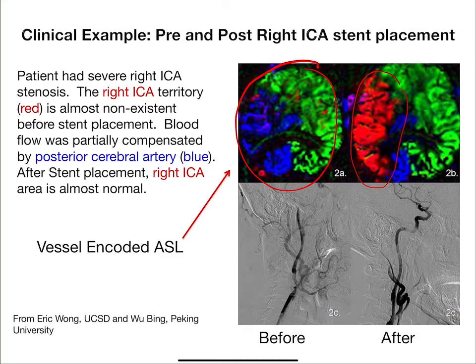Those of you who have done optimized pCASL actually have done this, so you actually have this information. If you want it, it's straightforward to set up, and might be useful for certain study populations. But it's a very cool technique that clinicians haven't really adopted yet. It's one of these things which seems really cool. Everyone loves it when they see the pictures, but it has not really been used that widely clinically yet, potentially because of workflow issues.